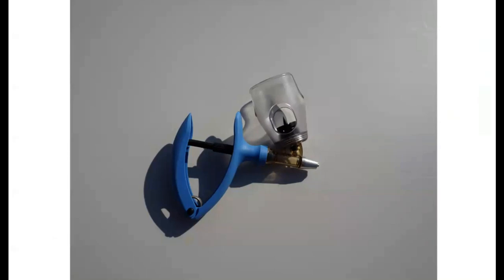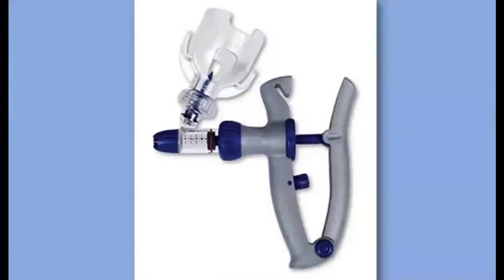This is another multiple-dose syringe, but it's designed a little bit different. It's actually designed for the bottle to stay attached to the syringe. Some people like these, some people don't. For me, it's a little more cumbersome to move in and out and around the chute. And also, when we think about keeping this cool, you have to set this version in an ice chest between each animal, which we'll look at some options for the barrel syringes that I think are a little more manageable for most people. But again, personal preference.